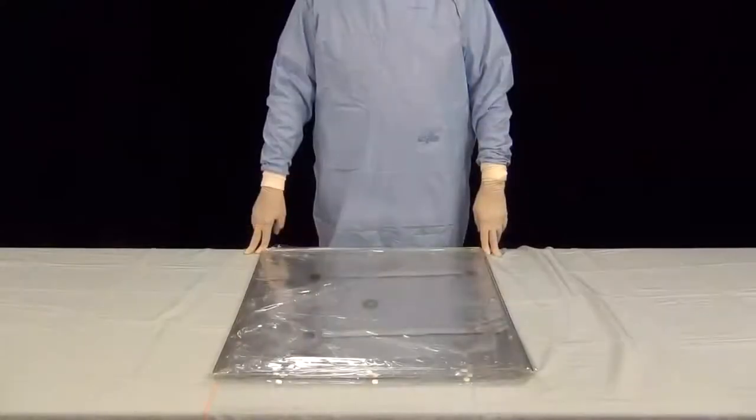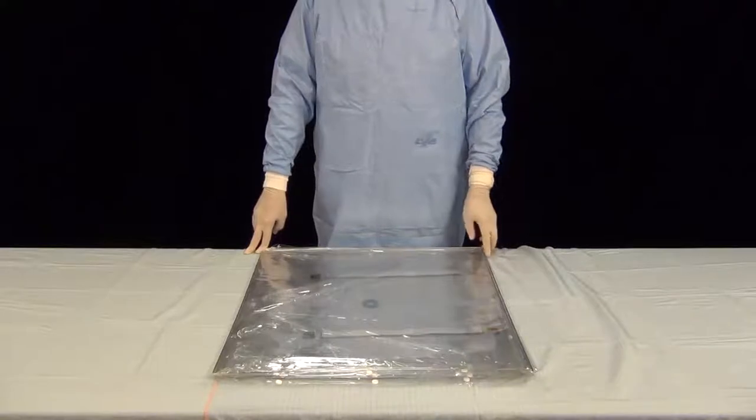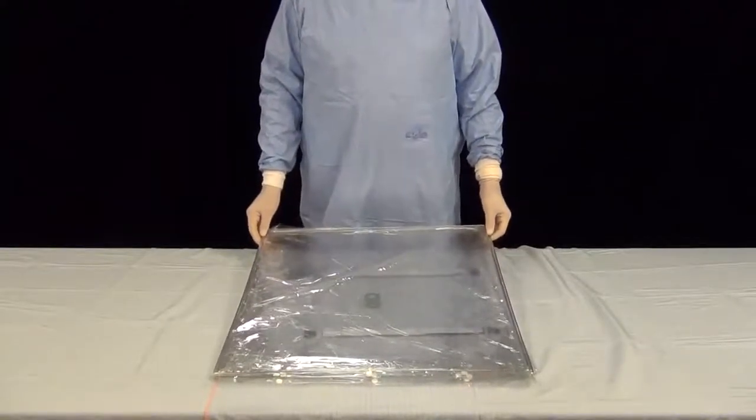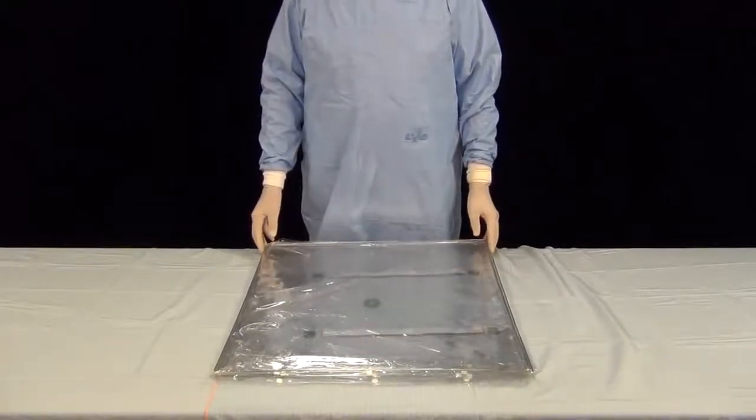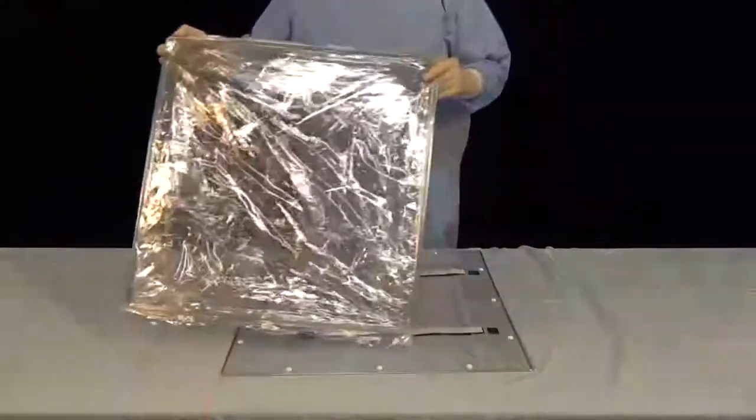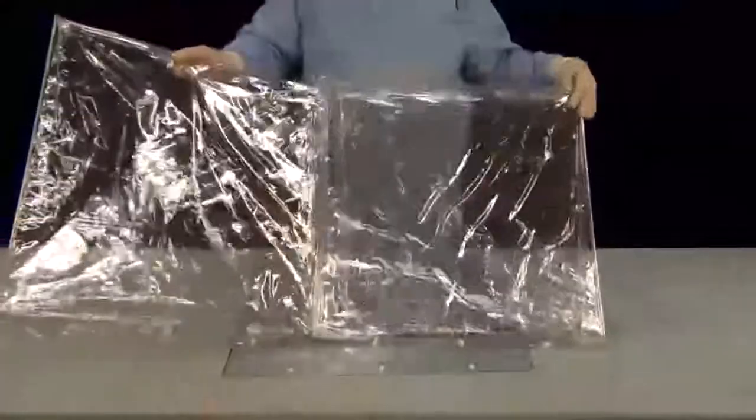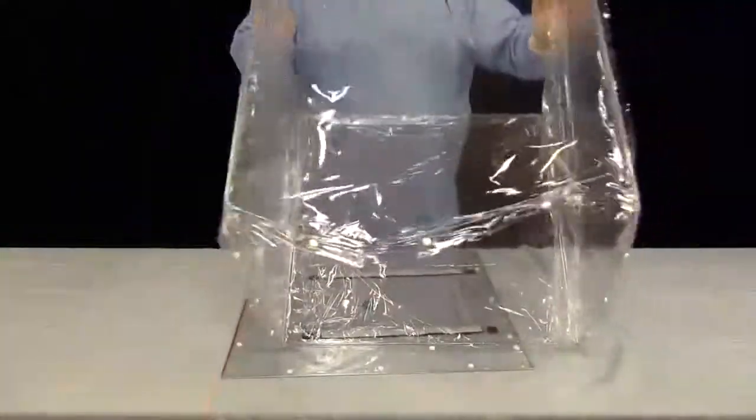Now that we've described our system for patient isolation and aerosol capture, let's get to the various components, and especially the most difficult one, which would be construction of the oxygen tent. Actually, it's not all that difficult. It consists of two parts. One part opens up to produce a temporary, partially stable tent.